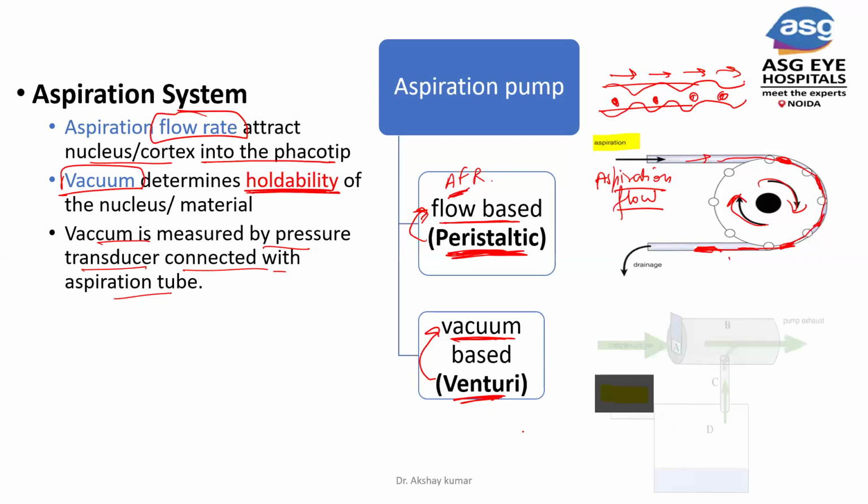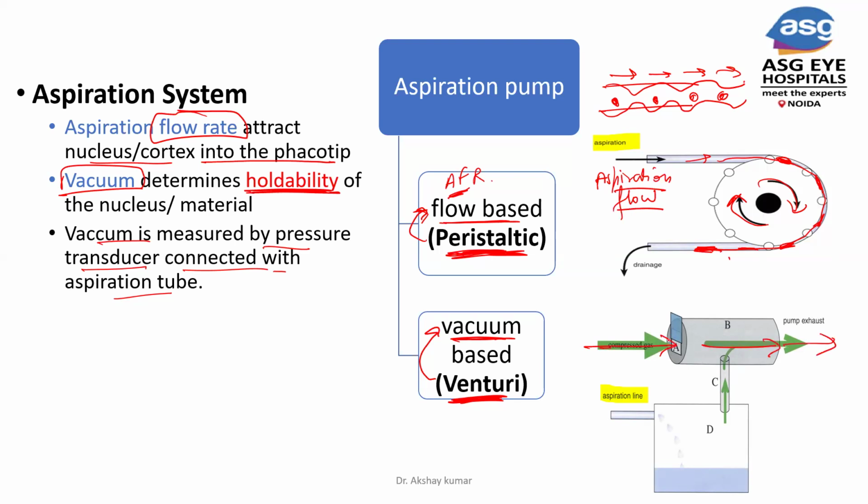And the vacuum-based pump. Can any fellow tell me what the Venturi principle is? Any fellow? So the Venturi principle is when a compressed gas travels through a closed chamber, it will lead to the development of vacuum, negative pressure, in the closed chamber which is directly connected to it.